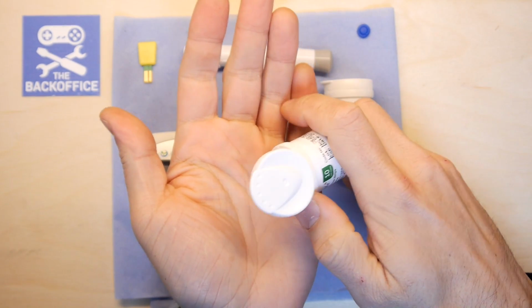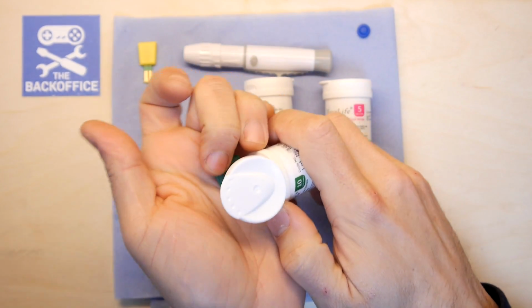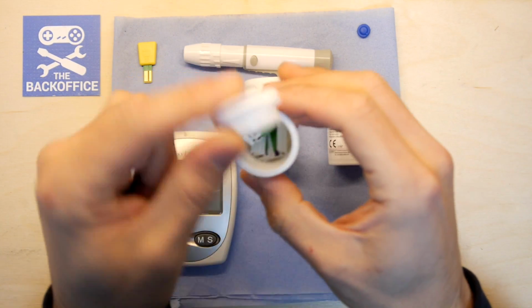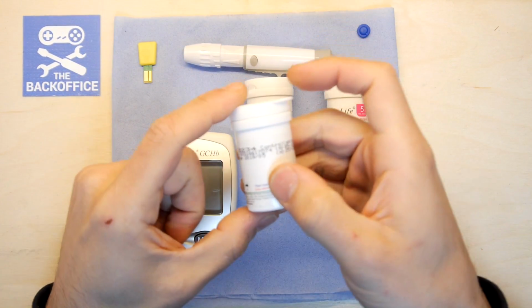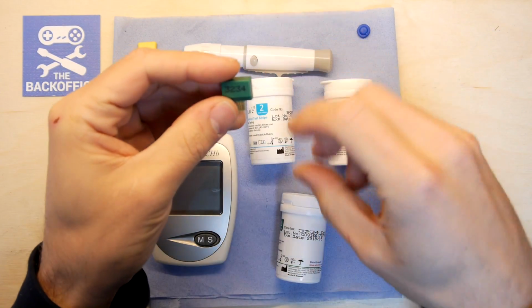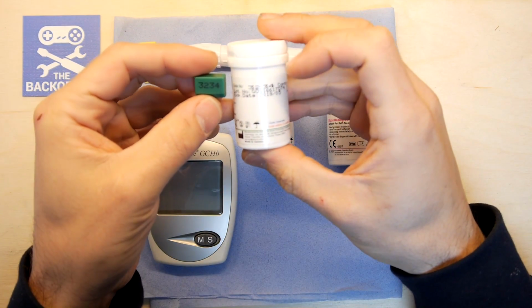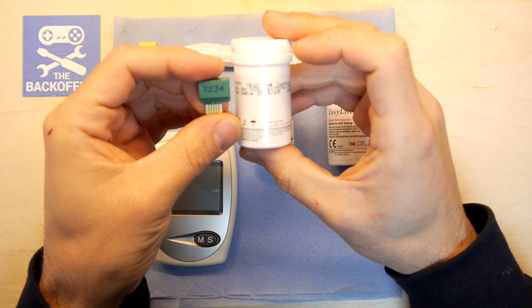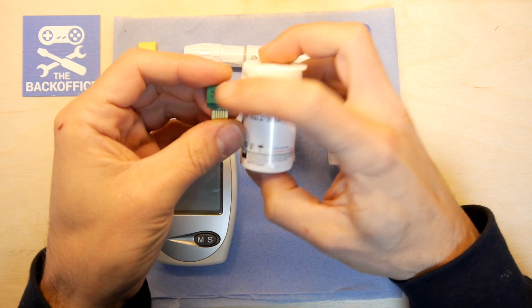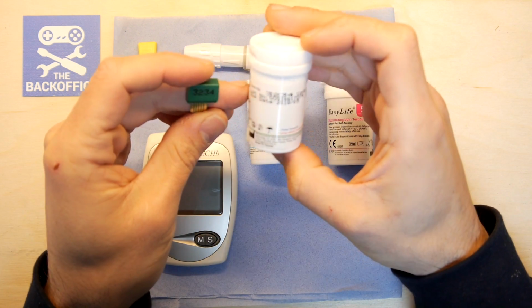Right, so these bottles are really thick. Look how thick this is. It's obviously designed to keep the moisture out, so I'm going to shut that right away. It says keep it closed, don't let any moisture in. But here's the chip you have. It's basically a code number that goes with the actual bottle. The control code is 3234 on this one, which is kind of interesting, really.